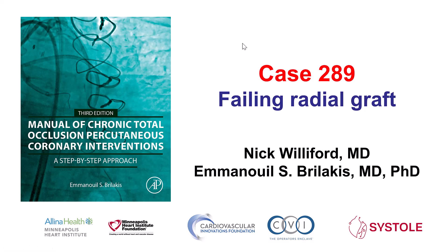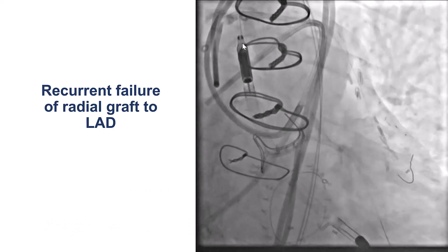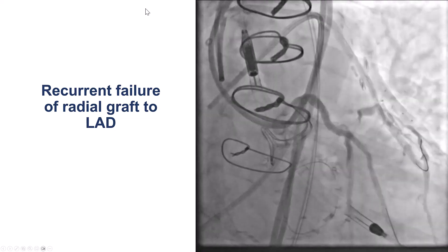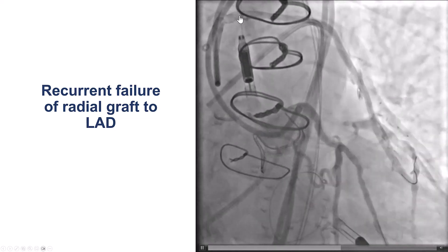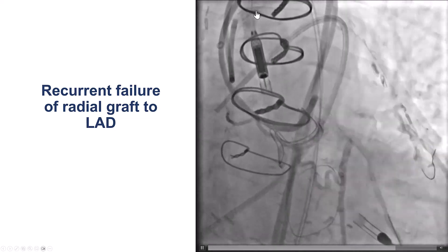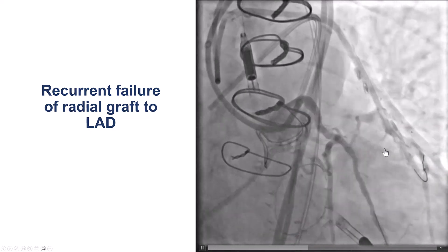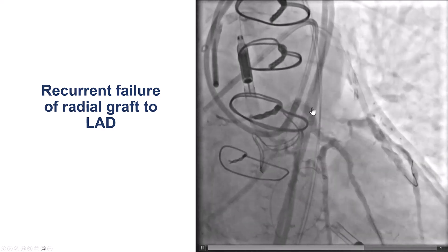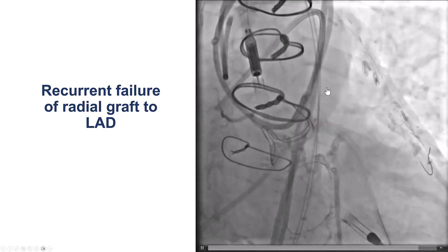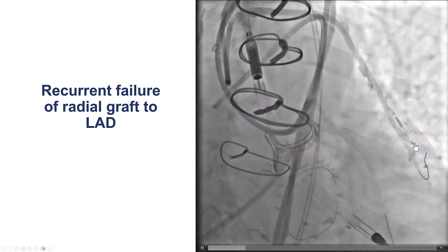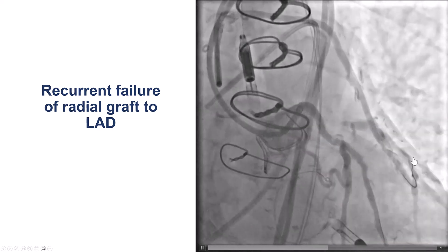This is Nick Williford and Manos Brilakis presenting case 289 for the Manual of CTO Interventions. This is a case of a patient with recurrent failure of a radial graft to the LAD. This is the coronary angiogram showing the radial graft that had multiple stents at the ostium. It kept re-occluding, and the question is what can we do next? He does have a flush ostial occlusion of the LAD, which is filling retrogradely and antegradely through this radial graft.